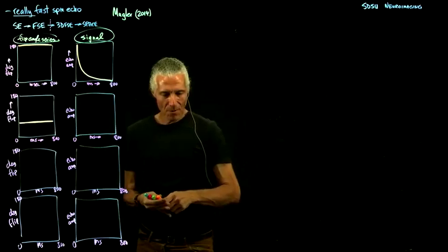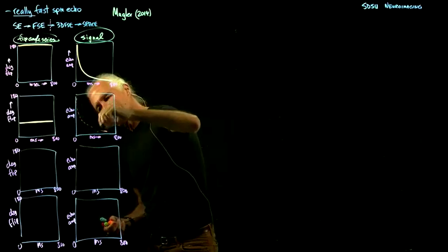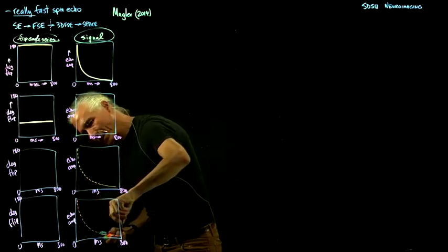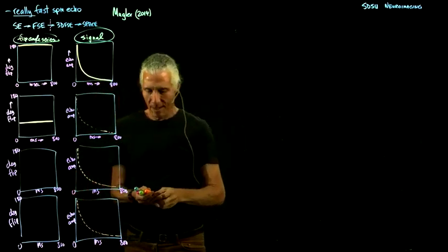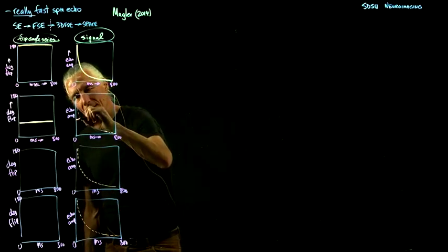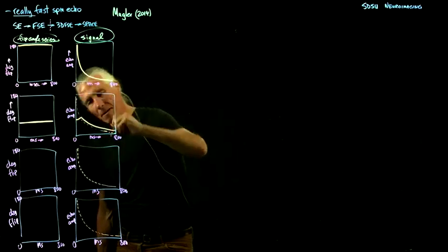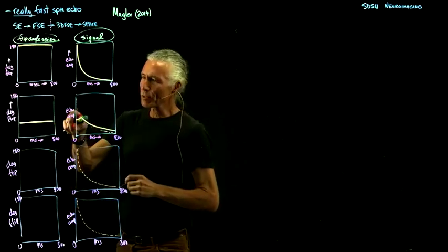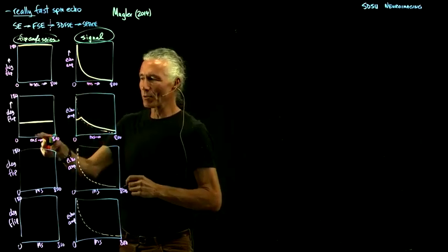And so what will that do to the signal? If I plot the original, here's the original one on all of these. It falls off a little quicker than that, but I'll just leave it like that. So what does it look like now? If you just do a 60, because of the stimulated echoes, you get something a little better. It's a little better, not that much better. But even though it's only 60, that's kind of a good thing. We beat what we had before, doing all these 180s, only doing a 60.